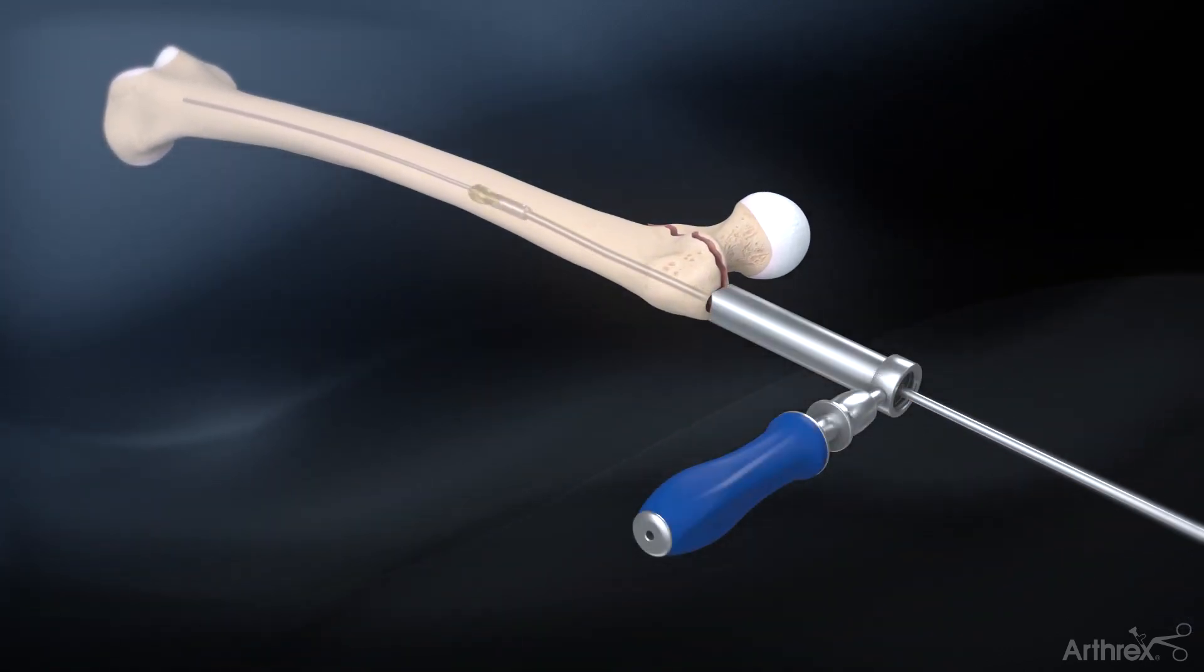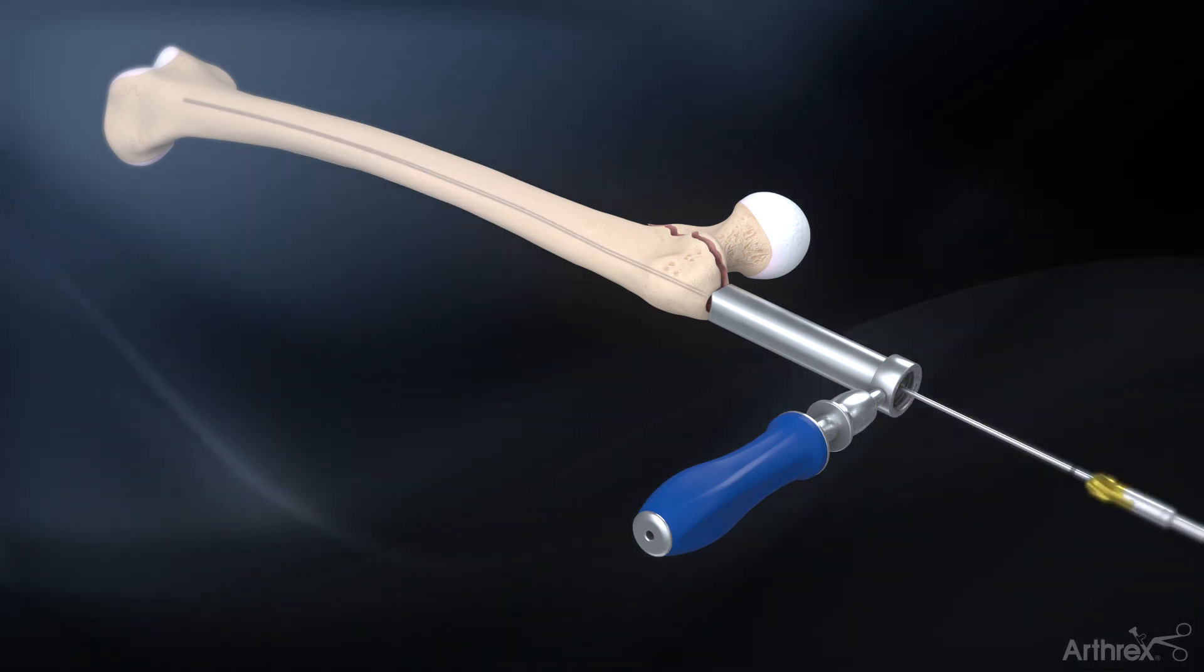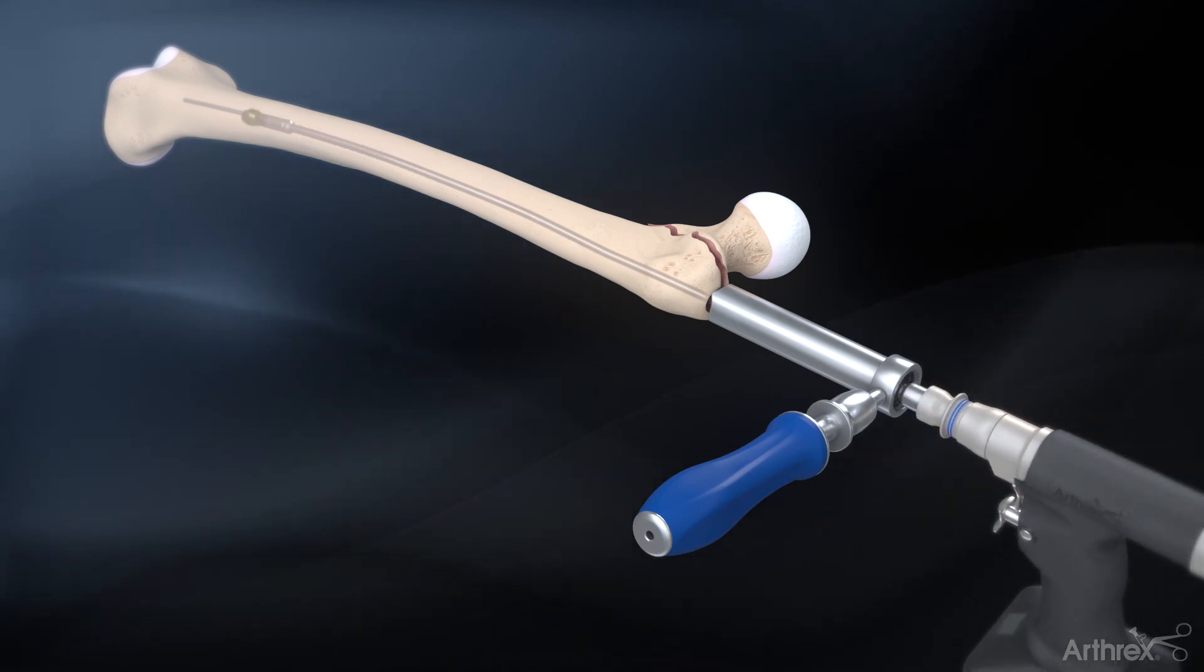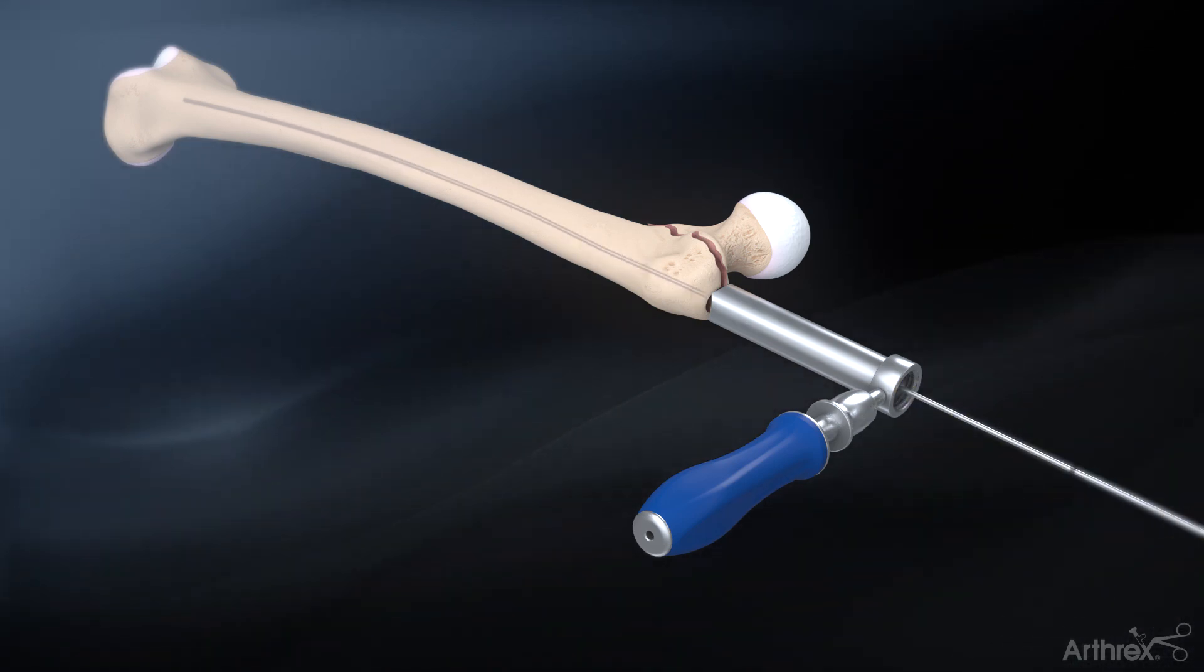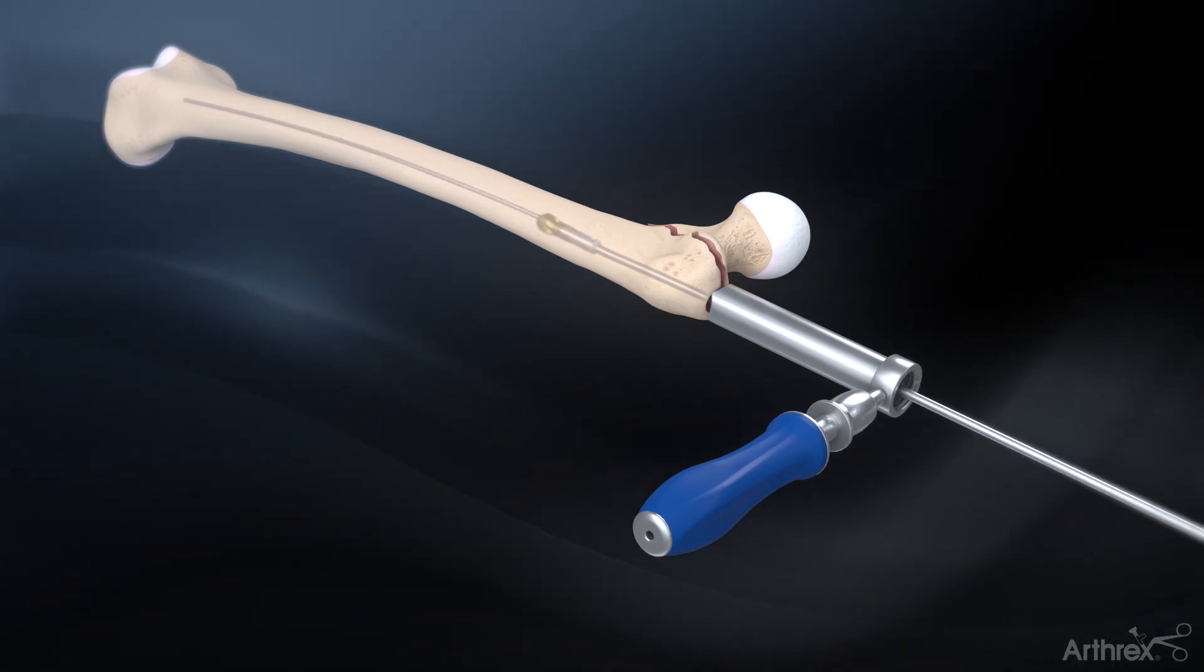Begin reaming with the 8 mm end cutting reamer over the ball nose guide wire. Sequentially ream larger with the side cutting reamers until cortical chatter is achieved. It is recommended to ream at least 1.0 to 1.5 mm over the desired nail diameter.